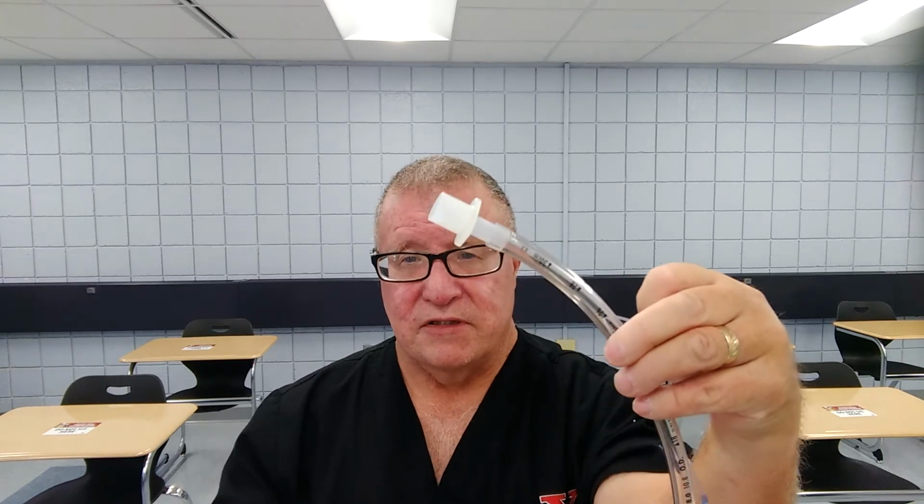Now, next thing we're going to go over is the respirometer, how to put it together, and what you do it. Now, generally, the respirometer is hooked on an end of an endo tube, okay, which similar to this. It's hooked on right here.